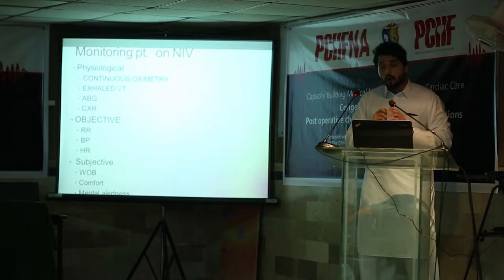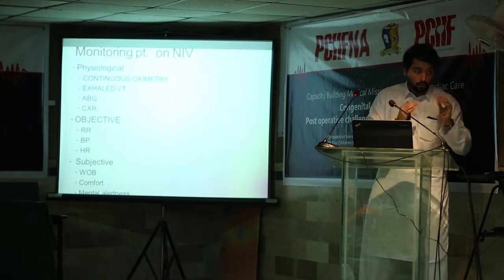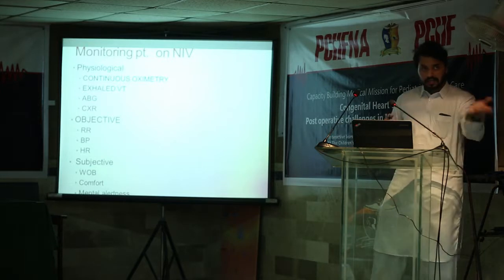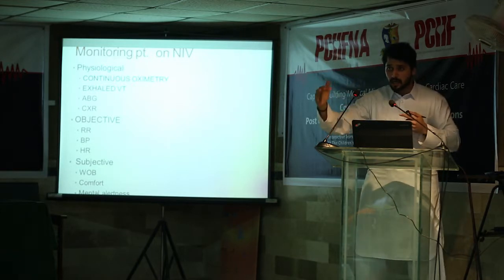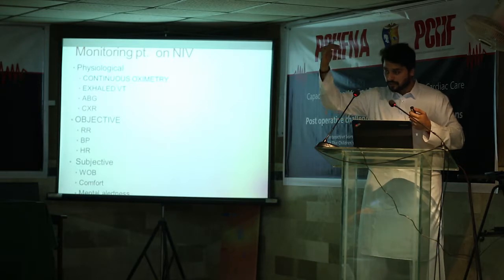Monitoring. Monitoring is very important. We always should monitor our patient, so we will make sure that the patient is on the safe side. So we should monitor the clinical presentation of the patient. Okay, when we apply the NIV, is this patient comfortable? Is his rate coming down? Is his saturation going up? Is his work of breathing coming down?